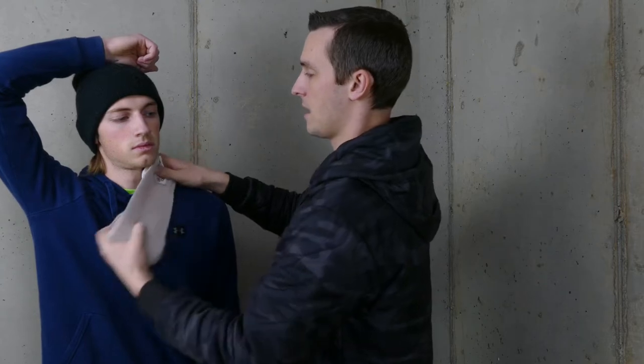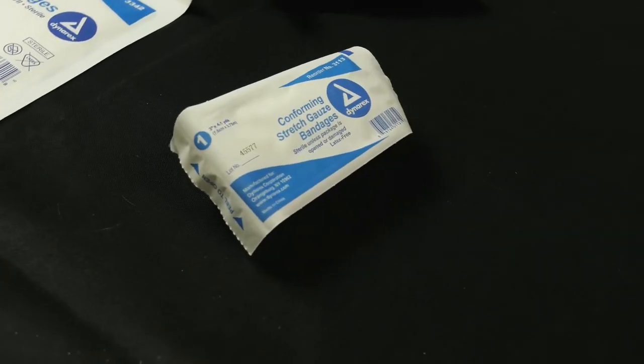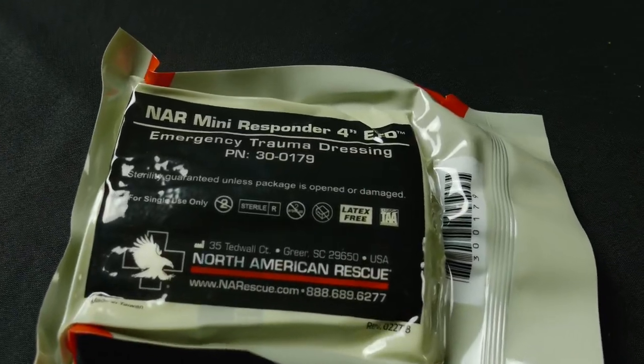Once we have the dressing in place, we're going to add a bandage on top of that. That bandage could be rolled gauze, pressure bandages, or I've got some co-ban or self-adhesive wrap here to wrap around it. The bandage is something that wraps in place to hold that dressing where it needs to be. Remember: dressing goes on the wound, and the bandage goes around to hold that dressing in place.